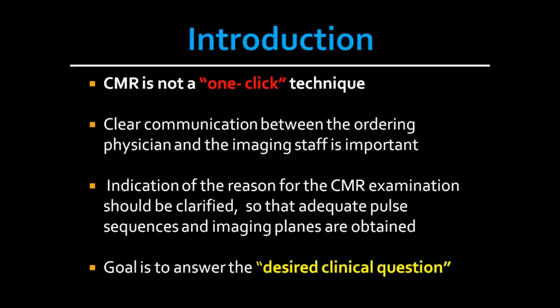And also, the cardiologist should know what the indication is, what is the reason I would ask someone to do the CMR examination, so he can plan the adequate pulse sequences and imaging planes that are obtained. And finally, most importantly, is to answer the desired clinical question. The clinical question could be: please, I want to know what is the viability. Is this myocardium viable or not before I do PCI or CABG?